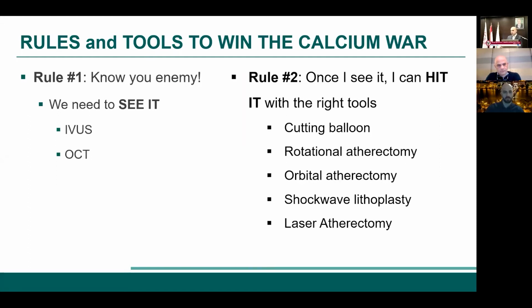And once you see it, you can choose the right tools. And again, we'll hear from Dr. Edis in his talk about his algorithm and his preferences. But briefly, you have cutting balloons, you have rotational atherectomy that was beautifully reviewed by Dr.